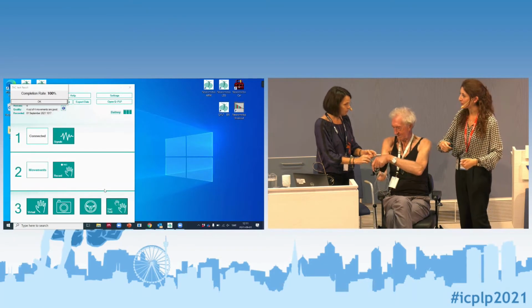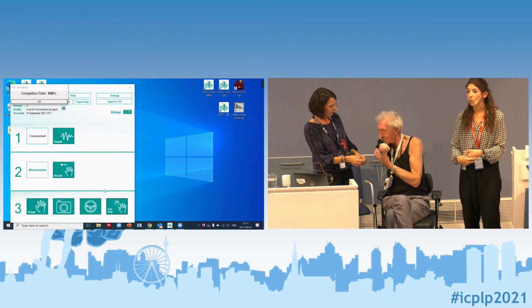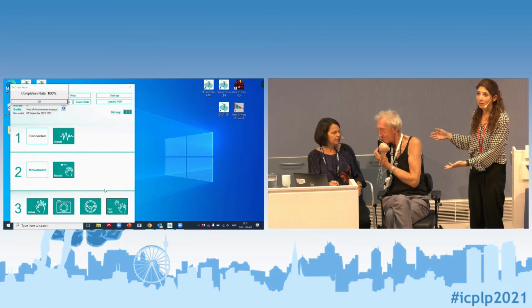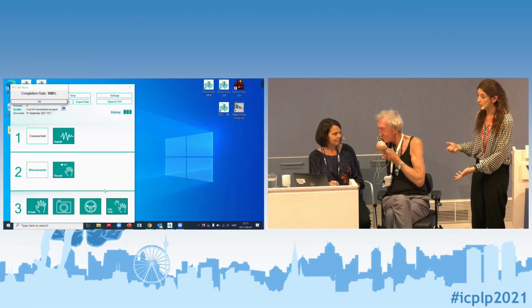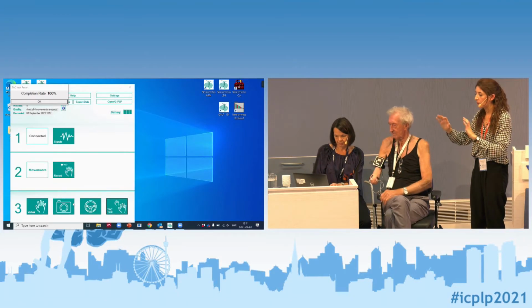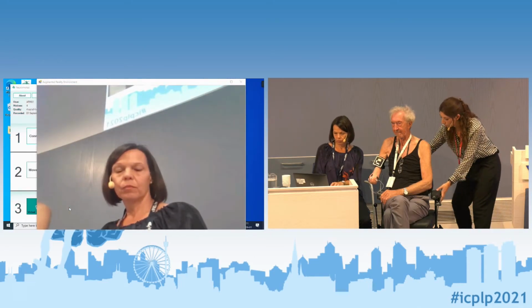Oh, okay, I can explain. So we have another step called augmented reality, on which we place a marker. He is a pro, as you see. He normally trains at home, so he actually put it by himself. So it's a marker, a fiducial marker, and you need a computer with a webcam. I think I will move you a little bit backwards.